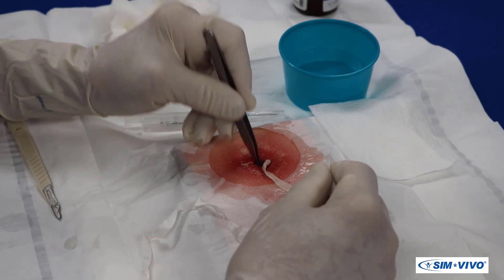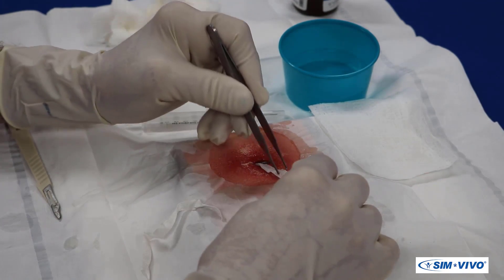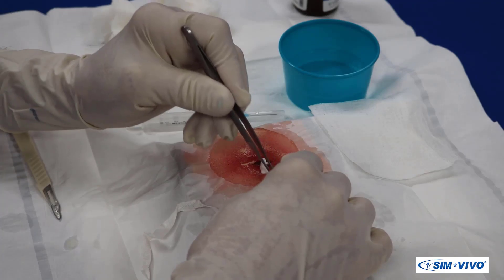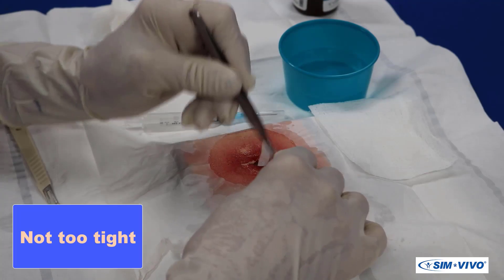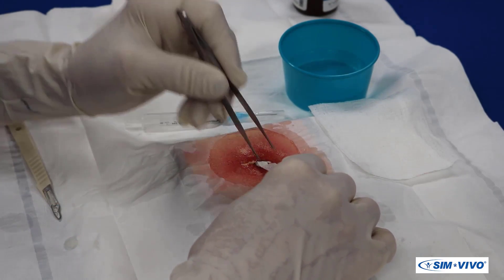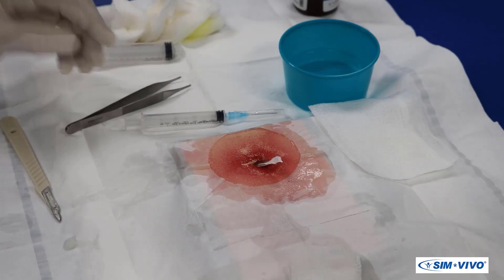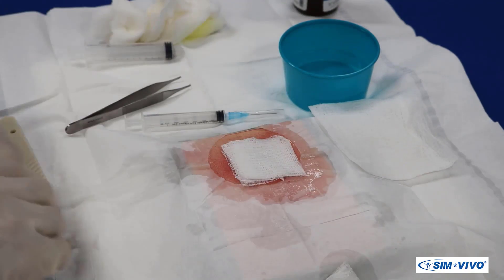With the forceps, grab the end of the packing strip and sequentially place it into the abscess cavity. The goal is to loosely fill the cavity to prevent premature skin closure and possible reaccumulation. Do not pack the abscess tightly unless bleeding needs to be controlled. If only part of the packing is placed in the cavity, cut the excess to leave a short section on the skin for later removal. Place a small dressing over the wound, which will be taped in place.